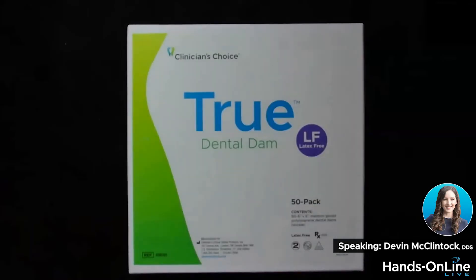This is the True Dam by Clinician's Choice. This is latex-free, so it's a great option if you just want to keep everything latex-free.